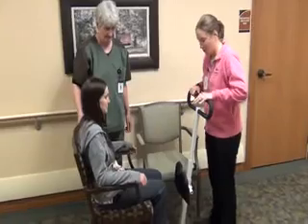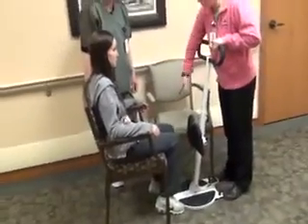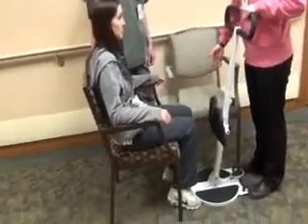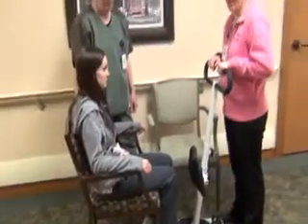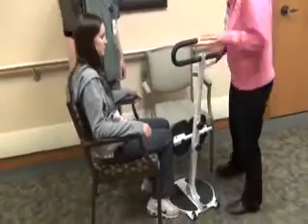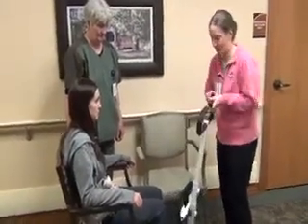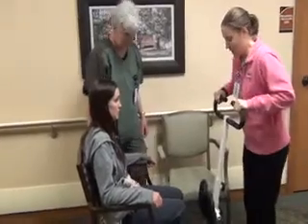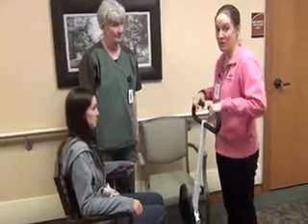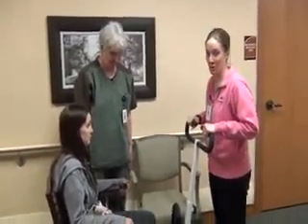We want to make sure the standing disc is positioned so that it allows for a smooth and close transfer to whatever surface you're going to. You have to imagine once they're standing and once you get them turned, are they going to be close enough to sit safely in the next chair? It's always important as we're doing the transfer that you're communicating with the patient what your expectations for them are, as well as communicating with your partner that's performing the transfer.